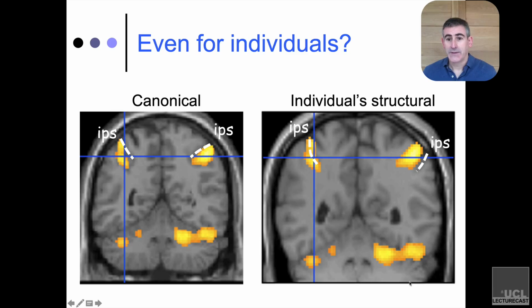One of the alternatives is that people often use what's called the canonical brain, or the Colin 27 brain. So back in the day in Montreal, there was a guy named Colin who volunteered to have, I think it ended up being 27 different structural scans of his brain. This is in the 90s. And as a result, when you average them, line them up and then average them all together, you get a very, very high resolution, crisp, beautiful image of a brain, Colin's brain.